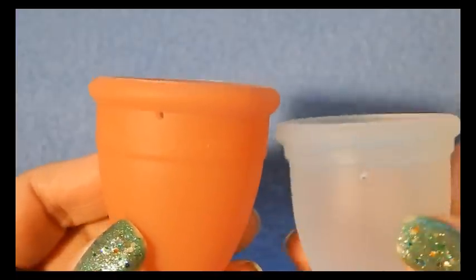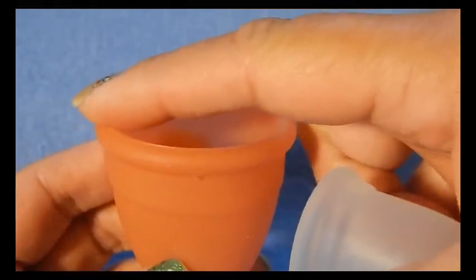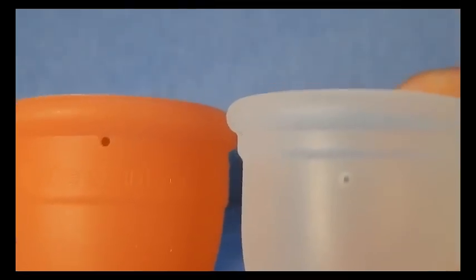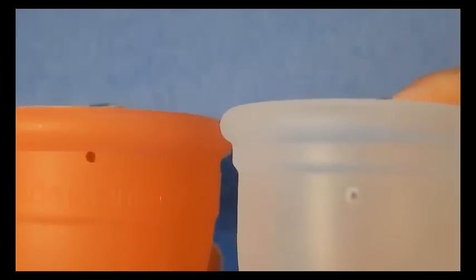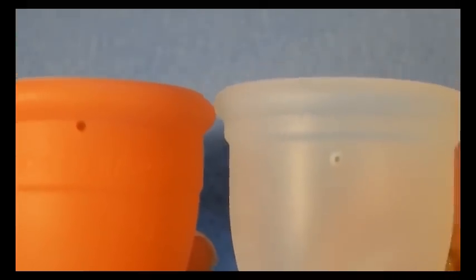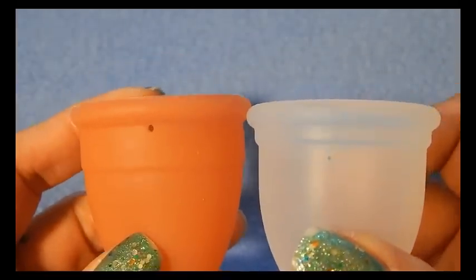Both cups have holes in the same position — evenly spaced around the cup and there are four holes. The Lunette holes seem a tad larger than the holes on the Ruby cup. The direction of the holes are straight — whether punched, molded, or drilled — there's no diagonal direction to them.